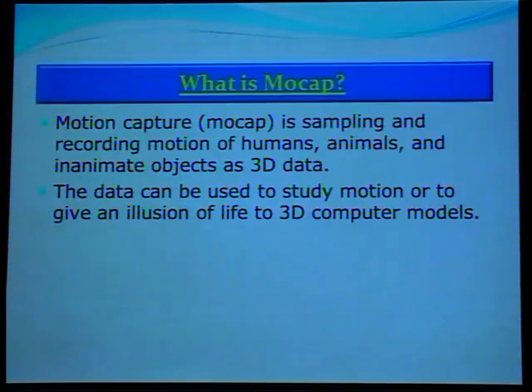Yes, of course. This is what motion capture is we're talking about. So what does motion capture do? It basically captures and records the motion of humans, it could be animals, in 3D.